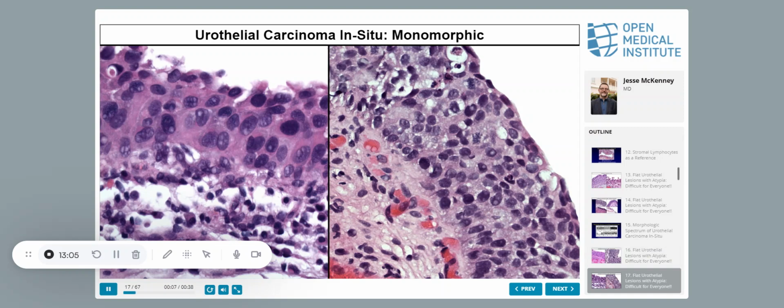And again, here's one where there's a lot of pink cytoplasm, but if you take maybe that's a lymphocyte, you can at least get 6 in here. These are very enlarged. They're very hyperchromatic. This is a nice example because these are starting to round up, but they don't look nearly as pleomorphic as some of the other cases I've shown you. If this is a stromal lymphocyte, again, you can put probably 5 or 6 in here.